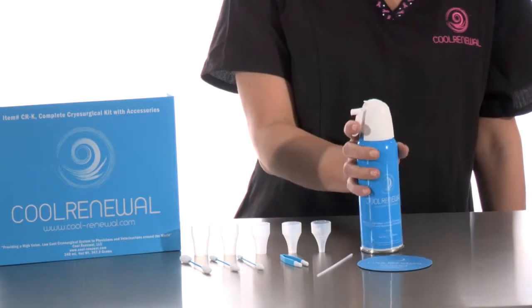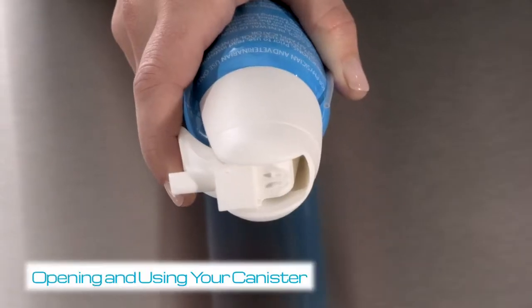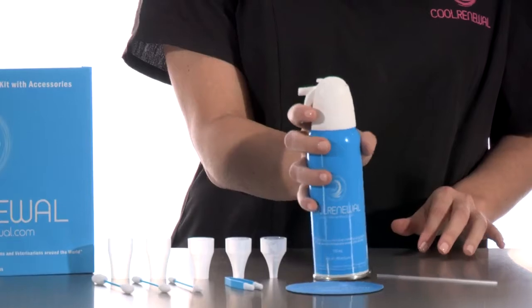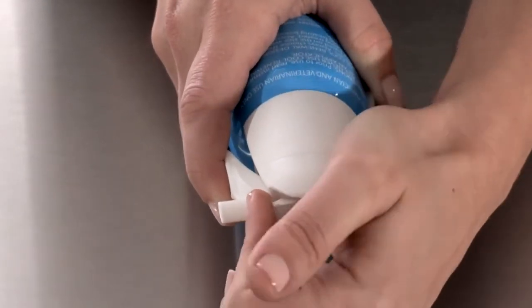Upon receiving your COOL Renewal kit, inspect your canister for damage prior to use. To open your canister, remove the safety tab located at the top of the white trigger nozzle. Place your index finger on the trigger to prevent damage to the nozzle and pull up on the safety tab.